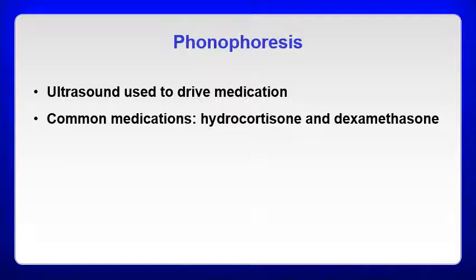Plus, like I said, it's tricky, because you have to really make sure that you're utilizing the right parameters if you are going to use it. If you did want to experiment with some phonophoresis, some ATCs will still utilize it based on experiences they've had with it in the past. We'll talk about some of the treatment parameters, if you were to use it, that have at least been most commonly deemed effective.